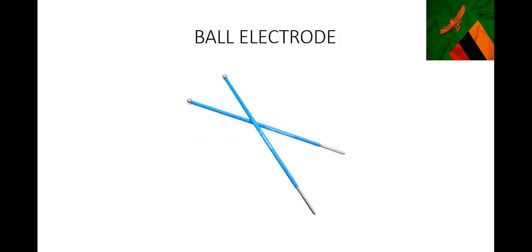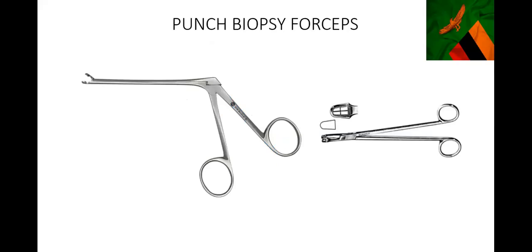This is a ball electrode. Once you cut with a loop electrode, sometimes there are bleeding parts, so you use this to touch those bleeding parts - the silver ball part is connected to electricity and is hot. You gently touch the bleeding parts to stop the bleeding. This is a punch biopsy forcep, also used in cervical cancer issues. When you see an abnormal lesion on the cervix, you punch that area to get a biopsy sample.